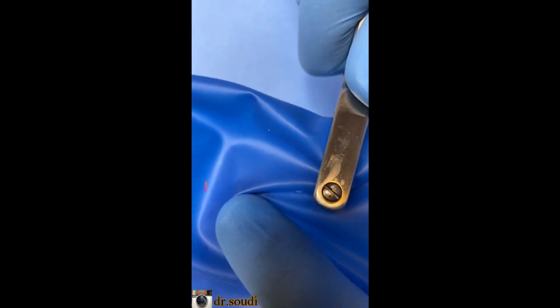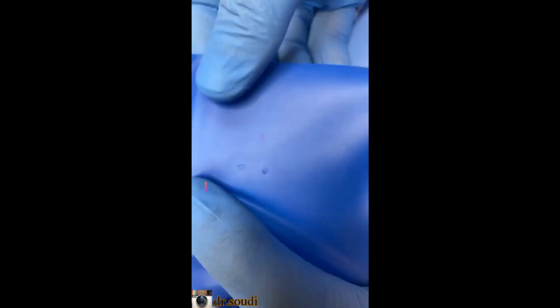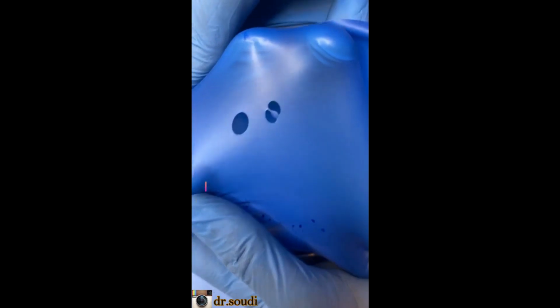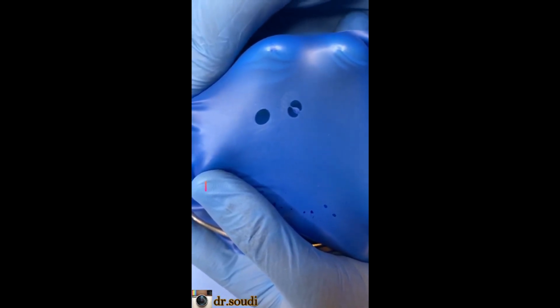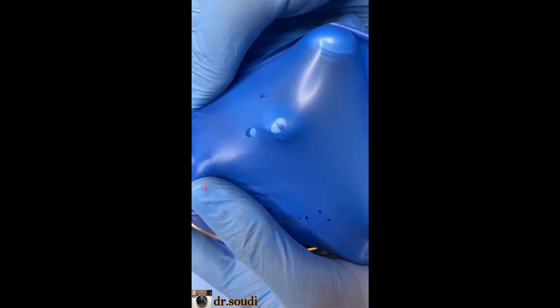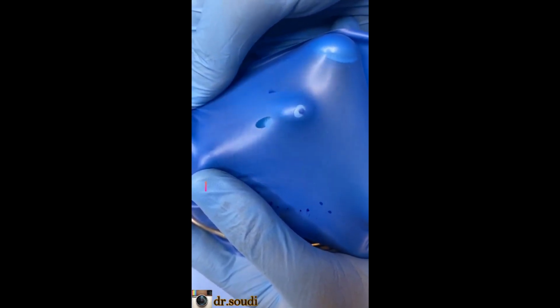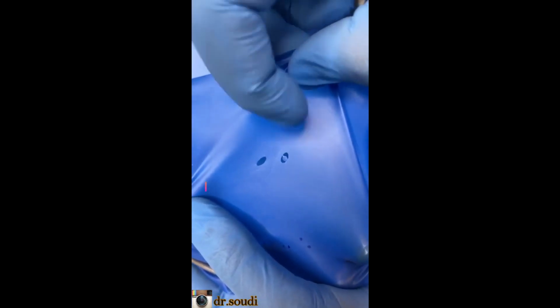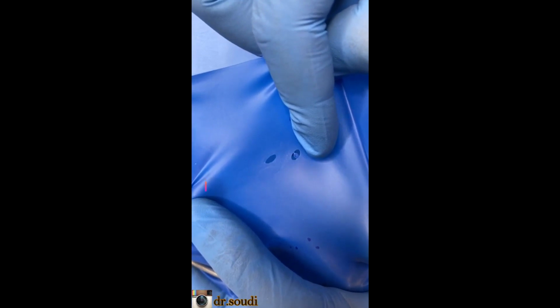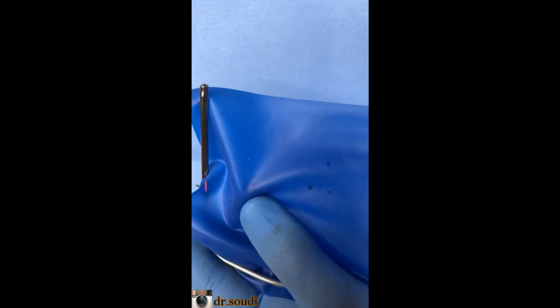Like this, if I am punching and looking at anyone and punch like this, you see the difference. Don't release your punch until you free your hole. You can see the hole is not uniformly cut. If you make this hole, this strong hole, and cut this part of the sheet, your sheet will be cut.